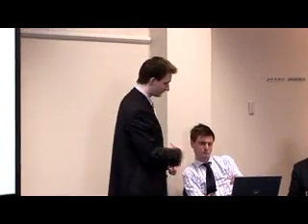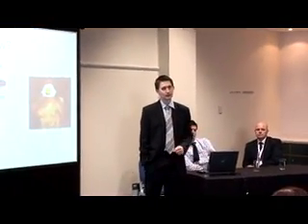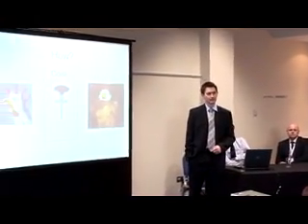Okay, and we can have a practice at the back with a few models that we've got. So how do you do it? Well, ATLS, I'm sure a few of you have done the ATLS course, practice on chicken bones, chicken legs. The Cook needle is the first one. Has anyone used the Cook needle from here, or practiced with it? Yeah, a few of you?